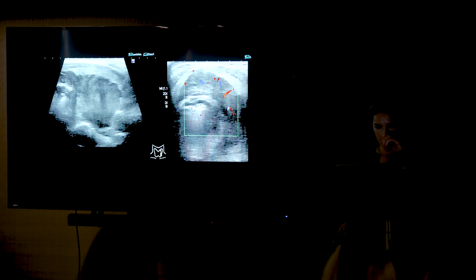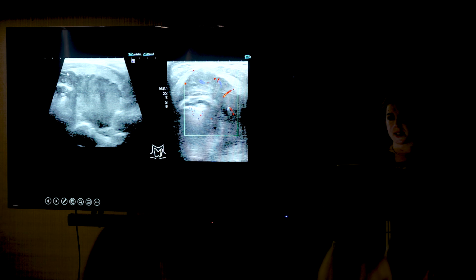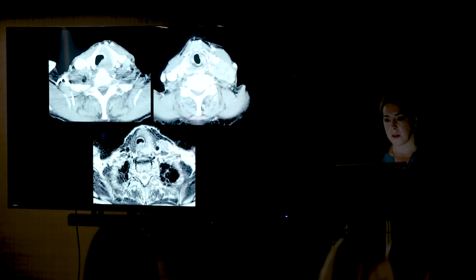Okay, interesting one here. So patient presenting with a goiter, and this is the appearance on the ultrasound. So trachea here, and this is the anterior border. We're over the isthmus here. So there's this extra soft tissue here. What grade would we give it? Would we FNA it? And that was a lymph node there in the left supraclavicular fossa. Ooh.